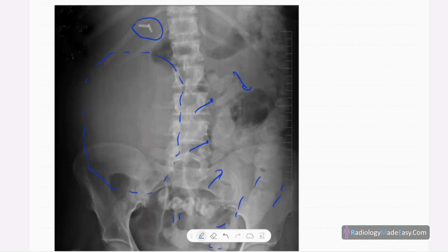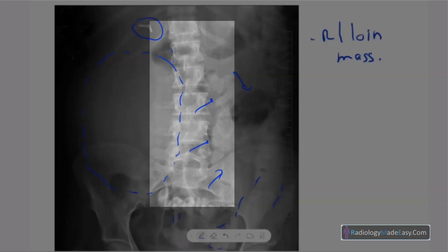So actually, it's a right loin mass. There are no high-density areas to suggest calcifications, so you have to exclude calcifications like staghorn calculi. There is also slight scoliosis with concavity to the right side.